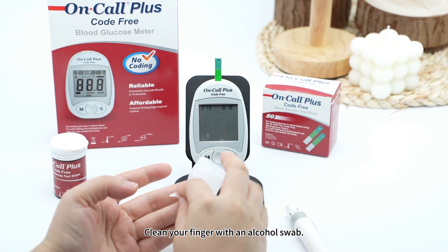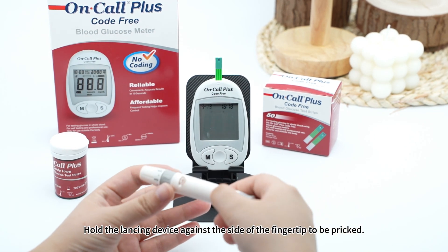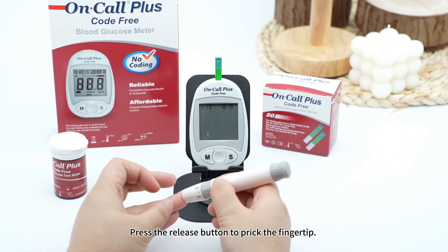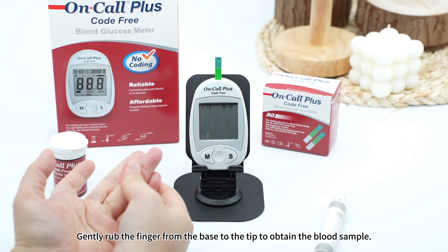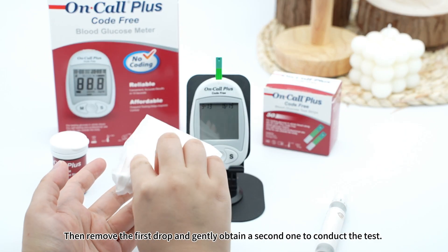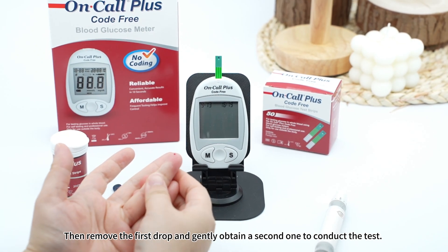Clean your finger with an alcohol swab. Hold the lancing device against the side of the fingertip to be pricked, and press the release button to prick the fingertip. Gently rub the finger from the base to the tip to obtain the blood sample. Then remove the first drop and gently obtain a second one to conduct the test.